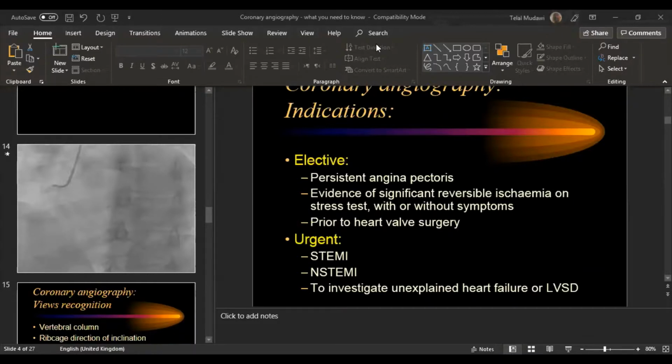يعني مثلا أديك مثال، جانا قبل فترة بسيطة patient بانتيريور ستمي والراديال بلس حقه سمحة جدا. دخلت راديال لقيت إنه عنده separate ostia للليفت مين، ما عنده ليفت مين، عنده separate ostia دي براها، اللي هو المقفول كله والسيركمفلكس. الكاثيتر دائما بتنجيج للسيركمفلكس، قدر ما غيرت الكاثيتر مرتين ثلاث بتخش السيركمفلكس، ابد تخش ال دي كله. ونحن ريسينج اجينست تايم، ال دي مقفول. فلو كان كولد كيس والعيان ستيبل، كنت ممكن استنى شوية واحاول اخش، لكن هنا ما في وقت. فهذي one of the cases we had to convert to femoral. اول ما خشينا femoral الكاثيتر براها خشت ال دي.